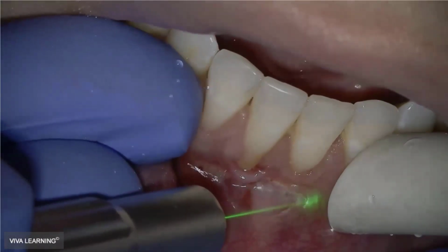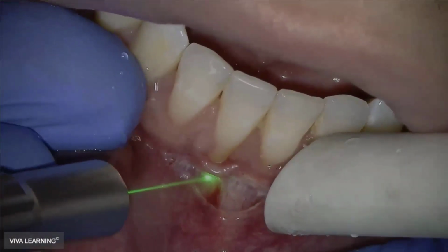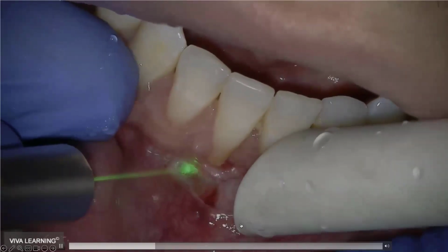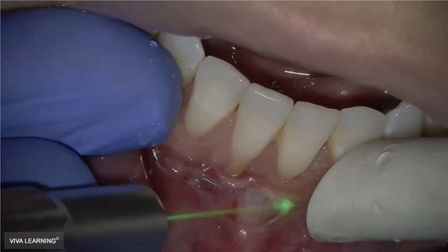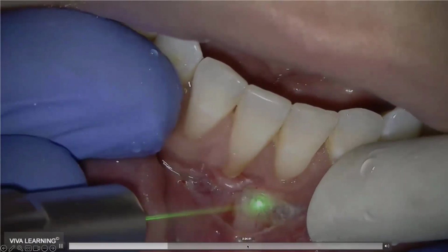Imagine pulling the lip away from the chin, and your working angle is essentially dissecting the lip off the chin. And I'm excluding that keratinized tissue, which will allow me to let that sit, and over the natural course of healing, it'll help boost that up.